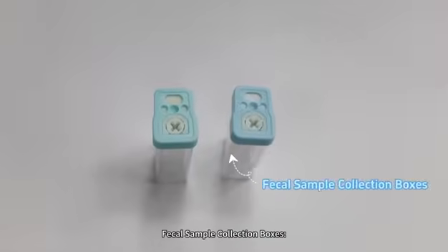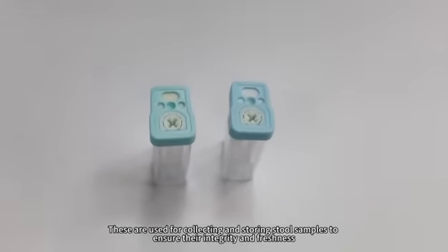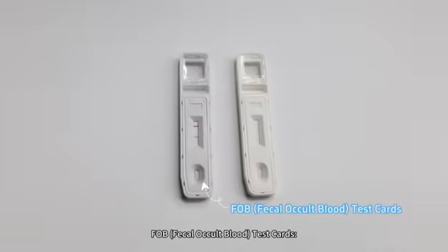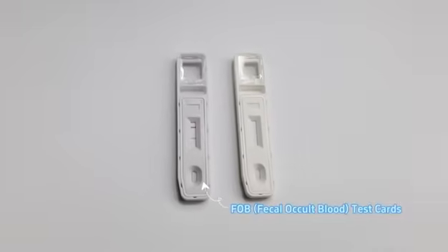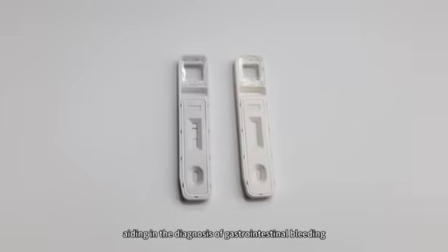Fecal Sample Collection Boxes: used for collecting and storing stool samples to ensure their integrity and freshness. FOB (Fecal Occult Blood) Test Cards: designed for detecting hidden blood components in feces, aiding in the diagnosis of gastrointestinal bleeding.